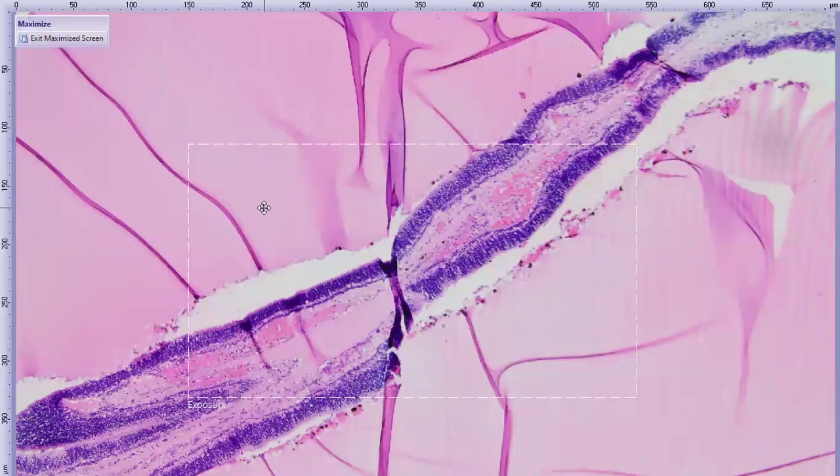So what they are describing here, and also the other eye, which is also very interesting, had multiple intraretinal hemorrhages and focal areas of low-lying retinal detachment. So whatever is happening here, it started happening in the other eye, which also suggests something systemic. So with the history of hyperproteinemia and biclonal gammopathy, and this very dense proteinaceous exudation throughout the eye that we see also inside the vessels, that is classic or strongly suggestive of what we call hyperviscosity syndrome, right?